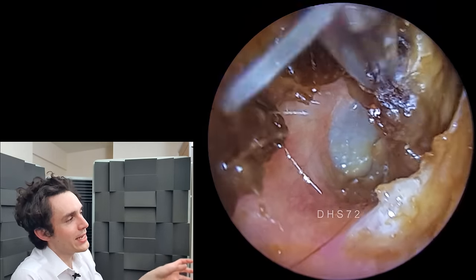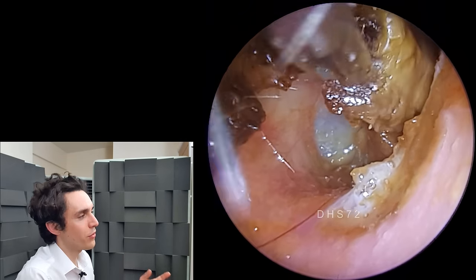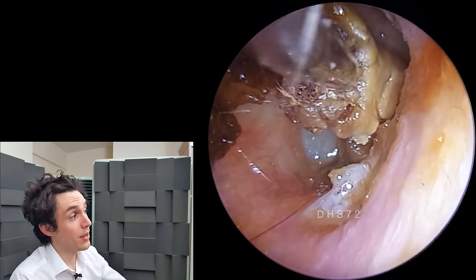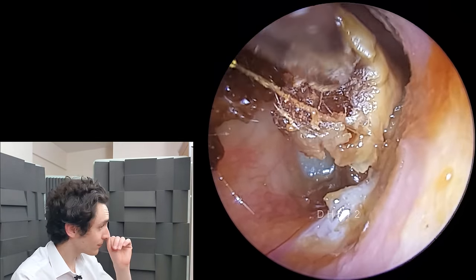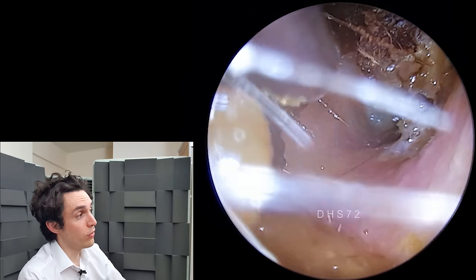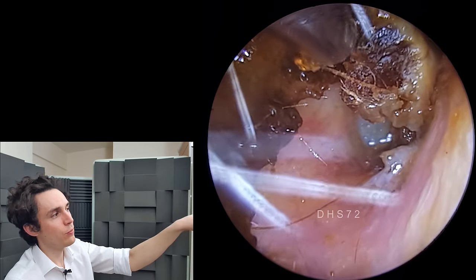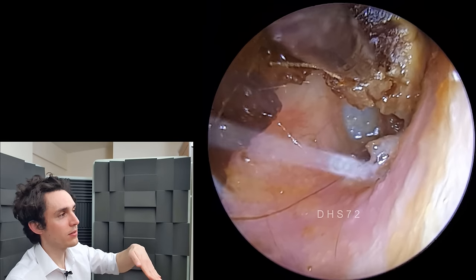And as you can see, it's all one piece. It's all moving as one piece, but it's rather awkward because it's such a weird shape that I'm having to work a little bit to loosen it up. The tail end of it is stuck in this little recess, which is rather annoying. But thankfully the patient has applied lots and lots of olive oil, and we should be able to drag this out no problem. You can see how it kind of spirals outward from the ear canal. The piece I've been working on is obviously the core of it, and then it has this long tail which is coming out of the ear canal.